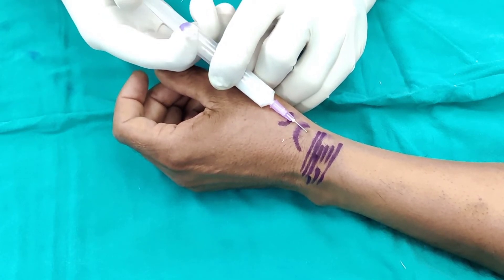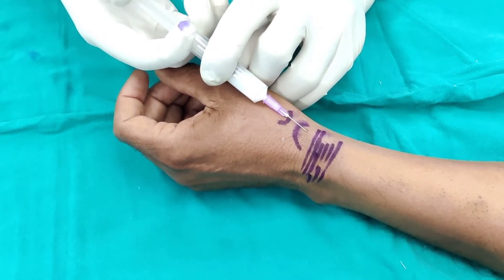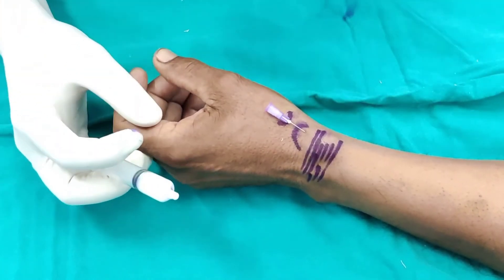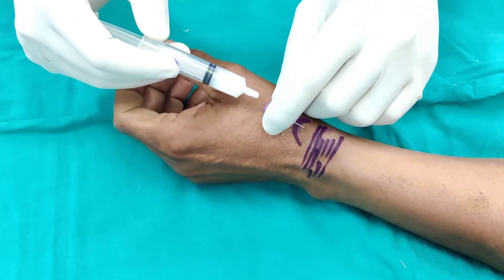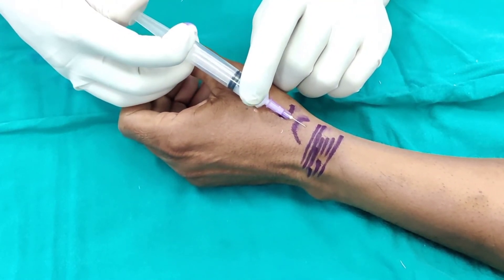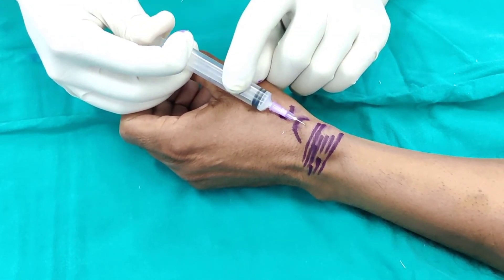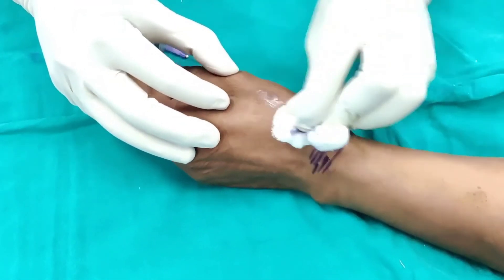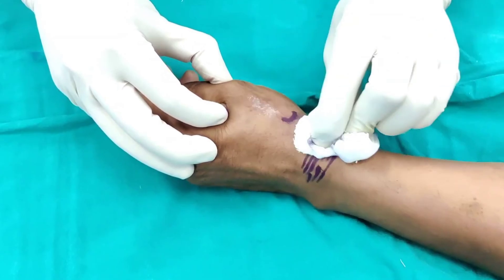If you want to be sure that you're not within the tendon, you can take away the needle and ask the patient to move the thumb. If it is in the tendon, it will start moving. On this occasion, we are safe. I'm going to inject 3 mils and then with a swab just redistribute it. And that is how you inject a de Quervain's tenosynovitis.